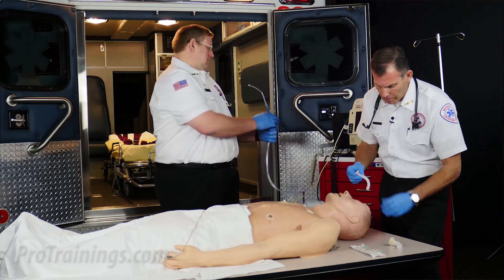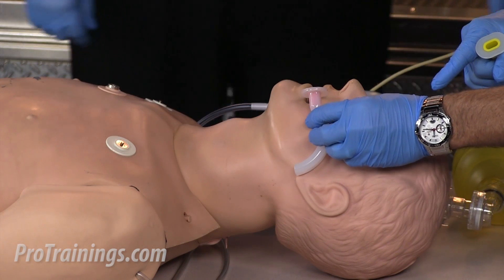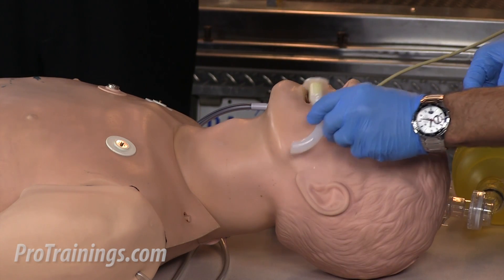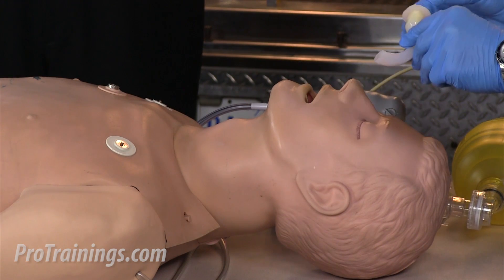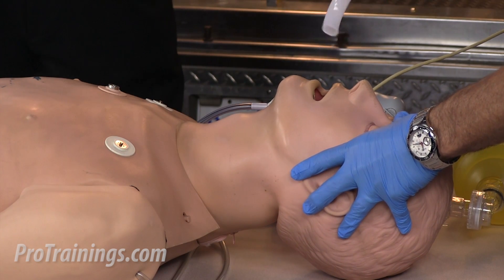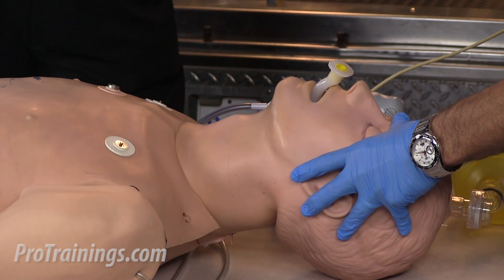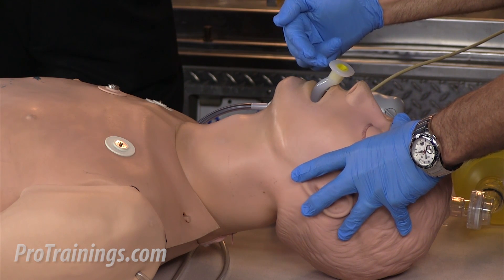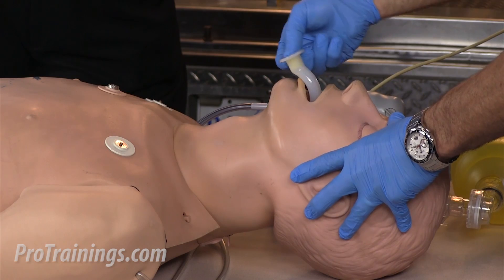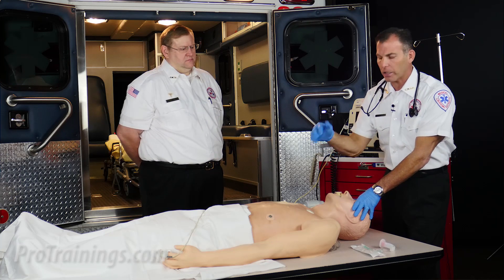In measuring this oral pharyngeal airway, we're going to go from the corner of the mouth to the ear lobe. As you can see, this red oral pharyngeal airway is a little long. I try the next size down and it's just about spot on perfect. The procedure for putting the OPA in is to invert the tube so that the end follows the roof of the mouth until it gets closer to the back of the oral pharynx. I then twist it, which helps move the tongue out of the way, bringing it forward and allowing air behind the tongue and into the lungs.